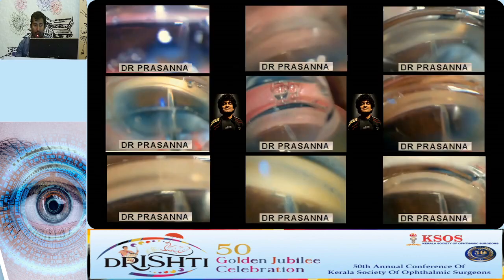There is nothing here on the metaverse, but I'll just tell you what it is. It's a virtual reality headset in which you have the Microsoft HoloLens, and once you wear it, you can see the virtual images in front of you in free space. And using your hands as controllers, you can grab these models. So it's a model of the eye in front of you. You can grab an iStent or a Kahook Dual Blade, and you can practice the surgery in front of you. So that is what the metaverse is created for.